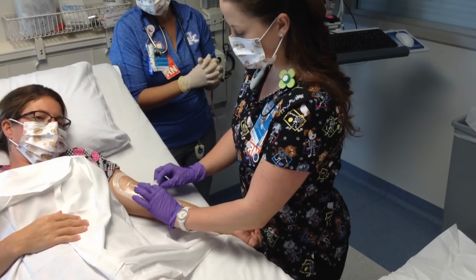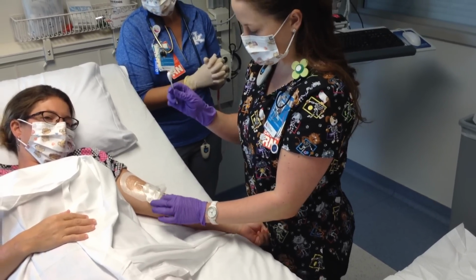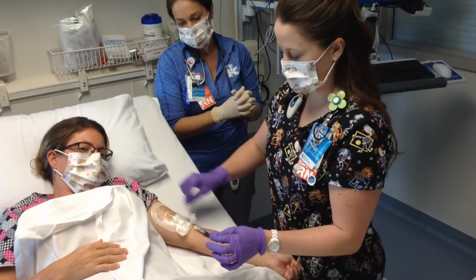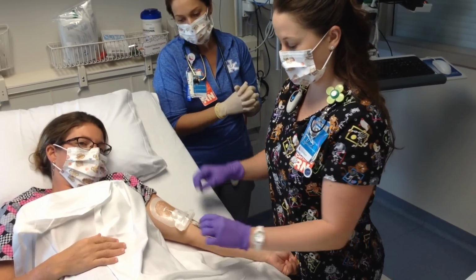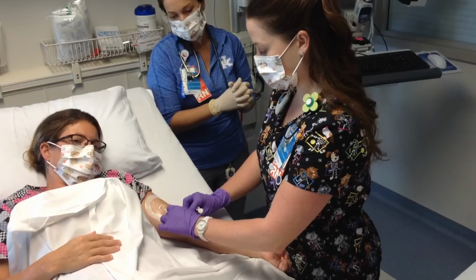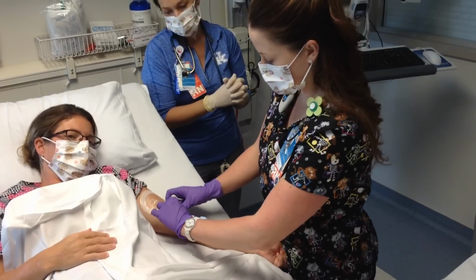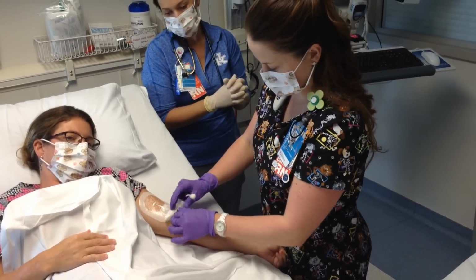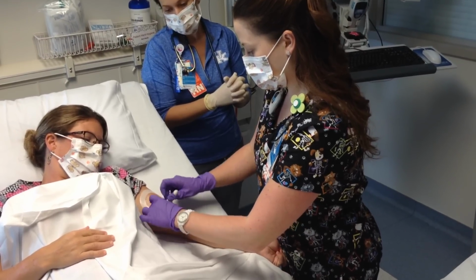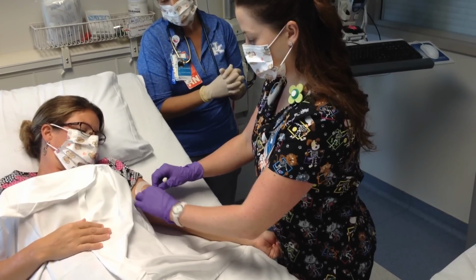And you can also use a roll technique when you're doing a 3M. So whenever you're using ChloraPrep swabs, don't wet the top of your dressing. That separates your dressing. You want to get up underneath so that this is helping remove your dressing from your skin. And as Lisa said with the 3M, once you get it off there, you can roll back, and it'll roll off the skin easily.